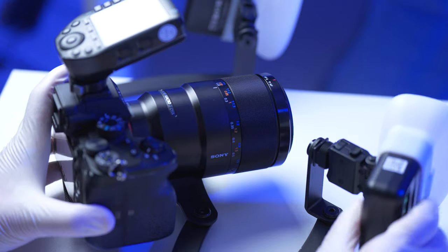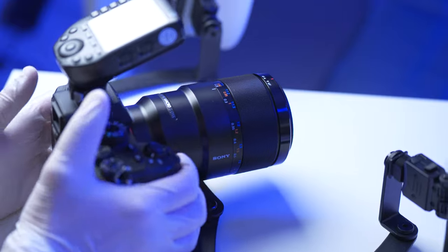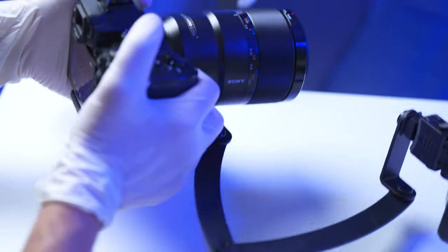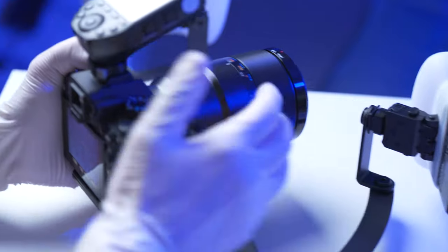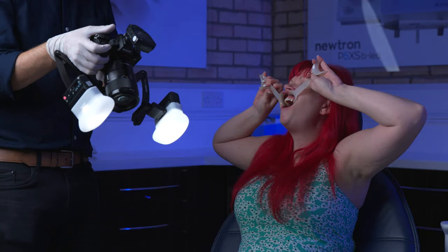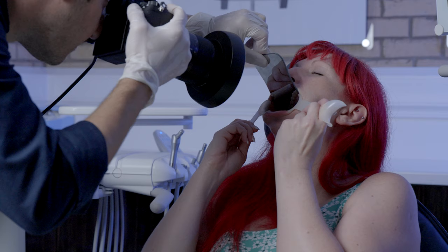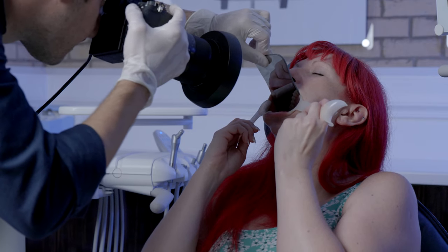The biggest difference and the choice between them ultimately comes down to complexity versus simplicity. The twin flash system is more adaptable with an improved aesthetic result but with added complexity, while the ring flash is much simpler to use but does not allow that same maneuverability.